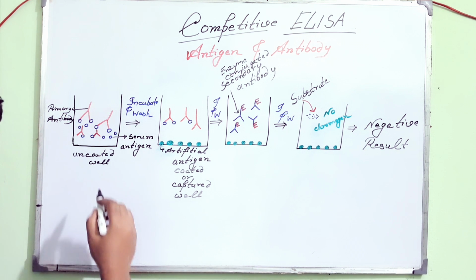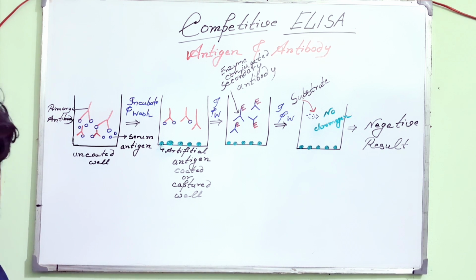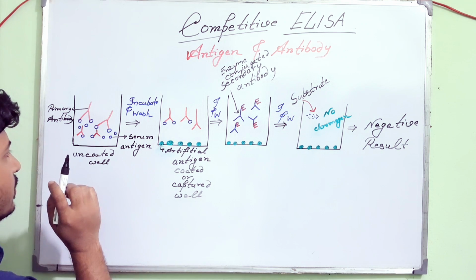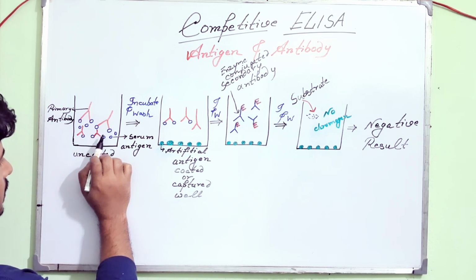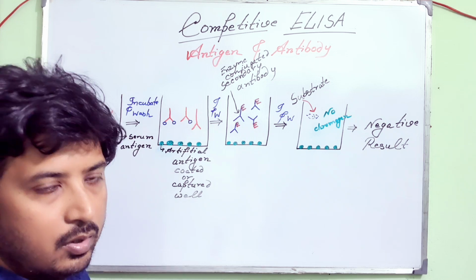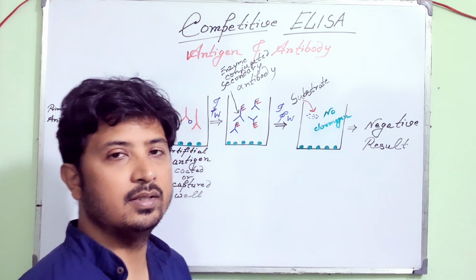Nothing is coated, neither antigen nor antibody. Now in this well, I have given first the patient serum, in whom I am going to detect the antigen.